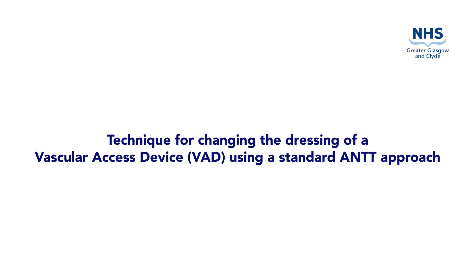This video is to demonstrate the preparation and procedure to change the dressing of a vascular access device using a standard aseptic non-touch technique. A standard ANTT approach may be used when changing the dressing of a vascular access device and is commonly used when redressing a PVC.